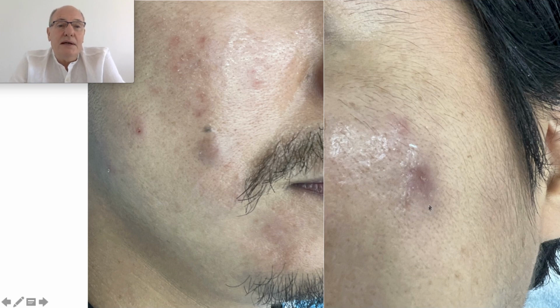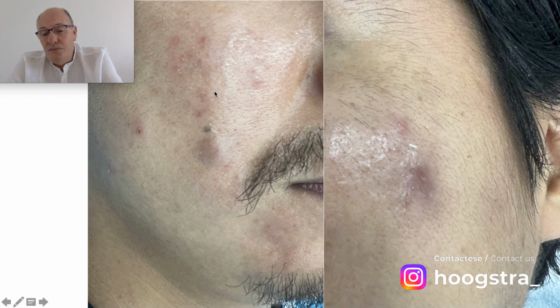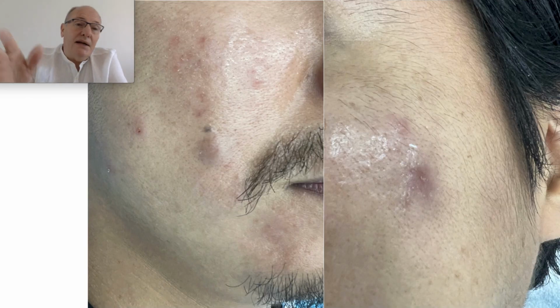Here we can see a little spot of infection, and the idea in medicine is prevention. What we need here is, once a month, to treat the skin in order to unblock, removing the upper layers, in order for the pilosebaceous gland to drain out.